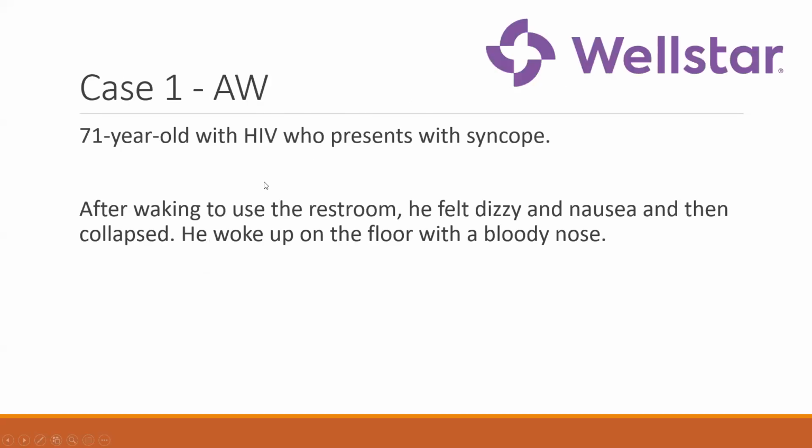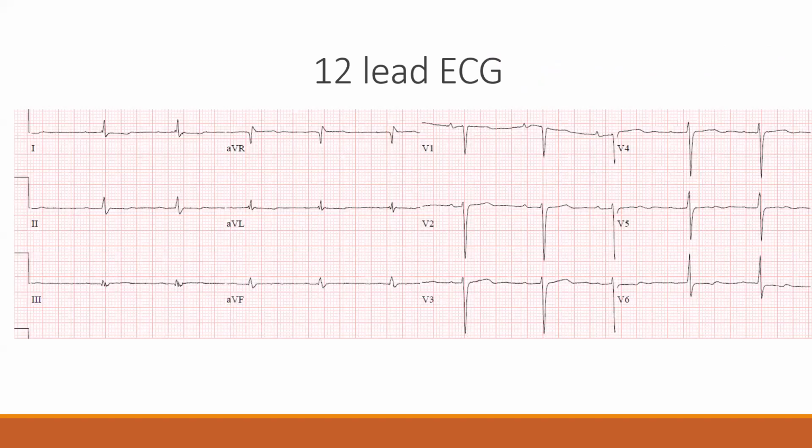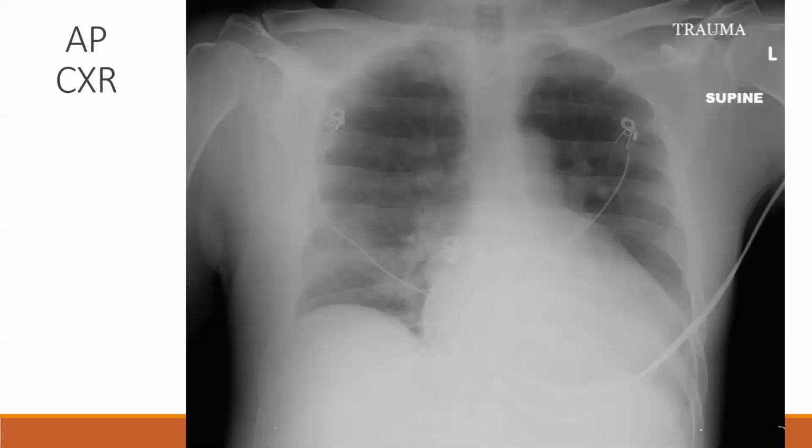So our first case is a 71-year-old man with HIV who presented with syncope. He said that he woke up to use the restroom, felt dizzy, developed nausea, and then collapsed. He woke up on the floor with a bloody nose. So he certainly had a traumatic syncope, but people that wake up at night and collapse, that can be for all kinds of different reasons. Here was his EKG, and we see that there's low voltage in the limb leads, but relatively preserved voltage in the precordial leads.